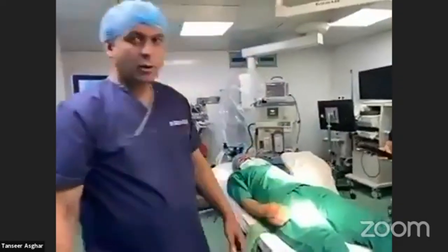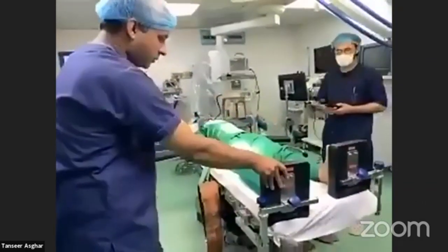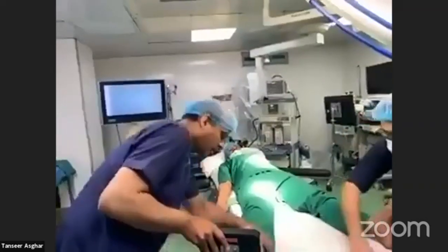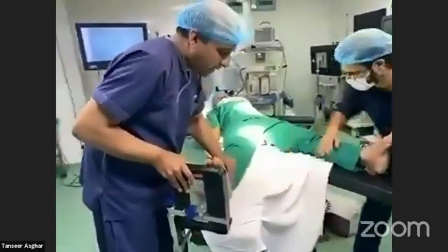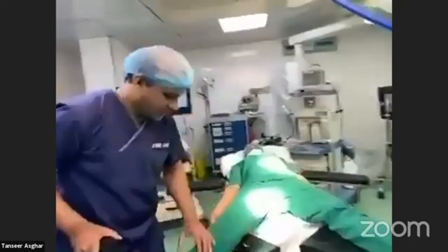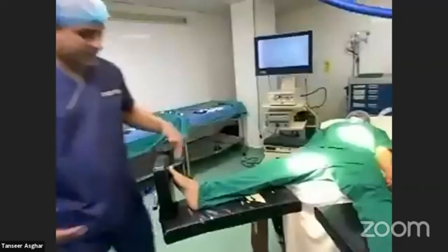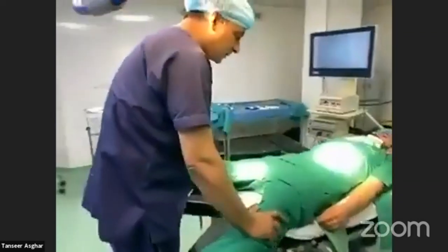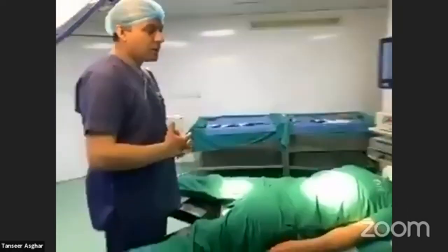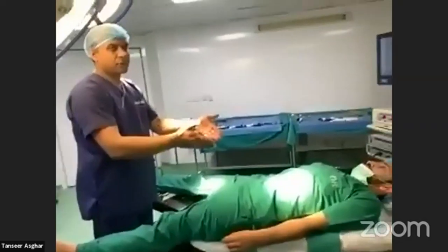Another important position is called the French position. There are two types of surgeons — those who stand on the right or left of the patient, and those who stand between the legs. When the surgeon stands between the legs, this is called the French position. Some surgeons perform cholecystectomy in this position, and most bariatric surgeons use the French position.